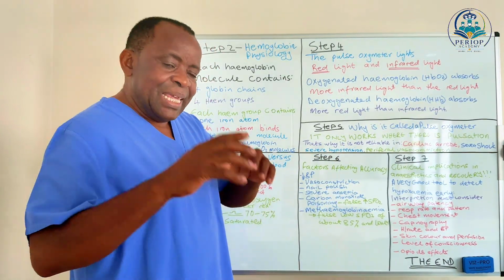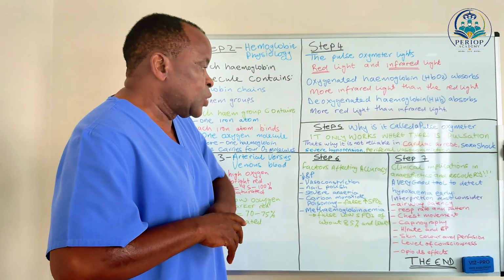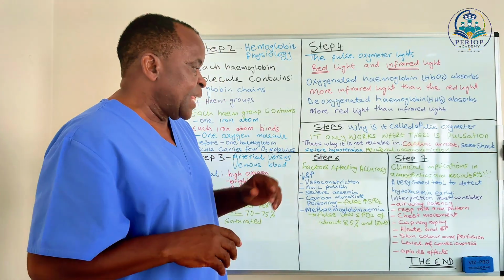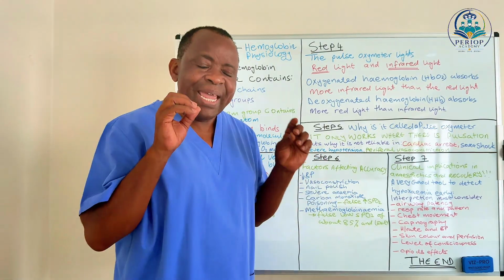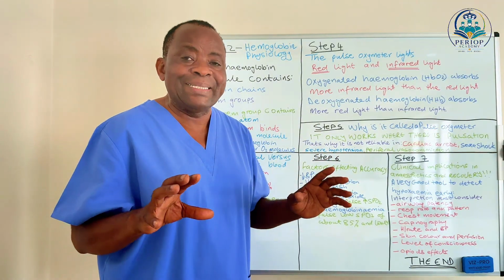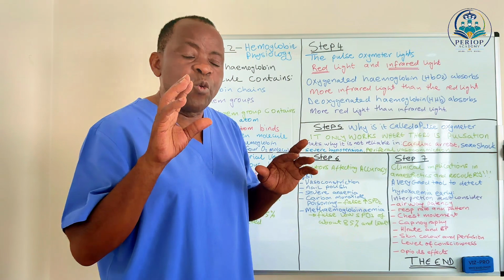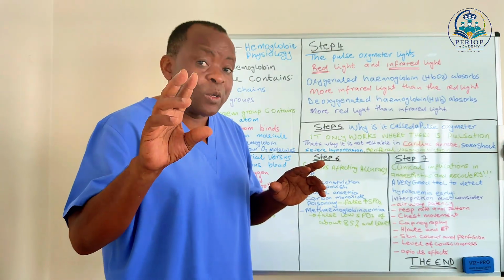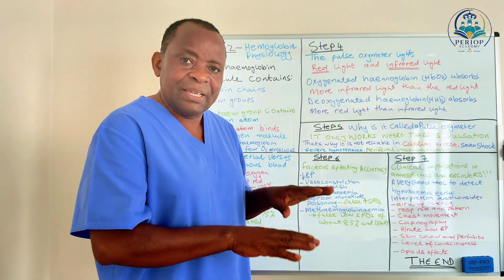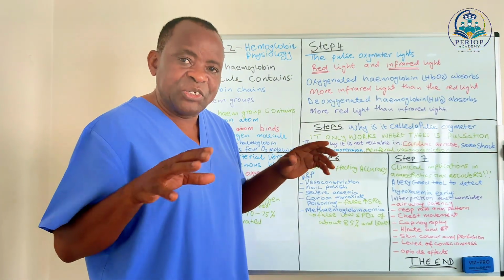So, in interpretation of this gadget in theatre, we also have to consider the following: the airway patency. We ensure that the patient's airway remains as patent as possible for the purpose of good maintenance of oxygenation. Any issues which interfere with airway patency must be addressed.